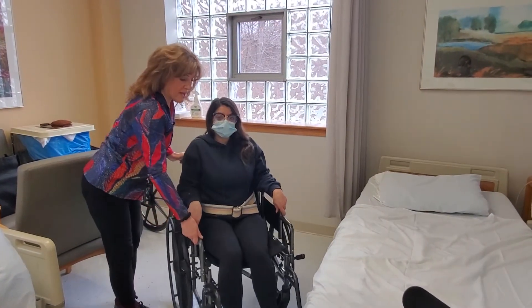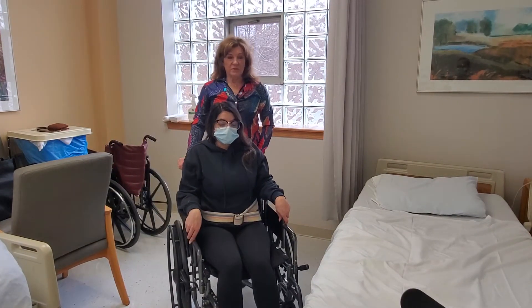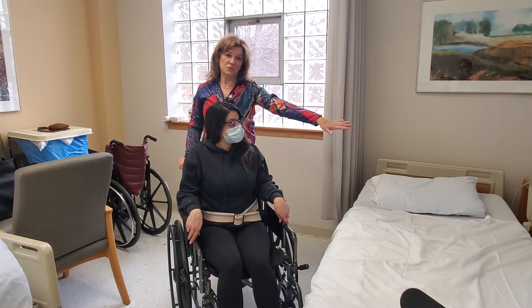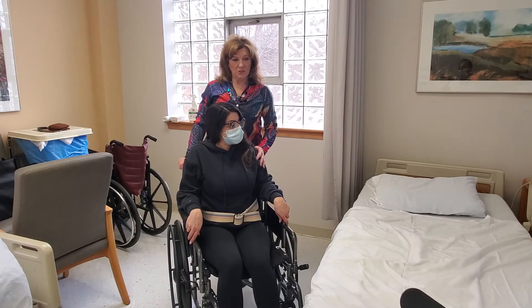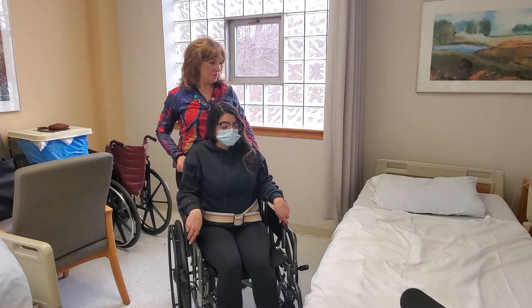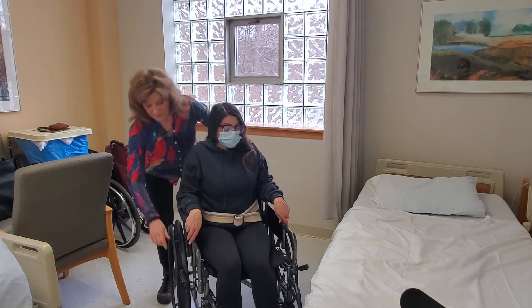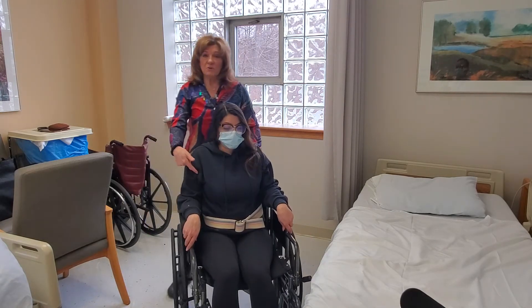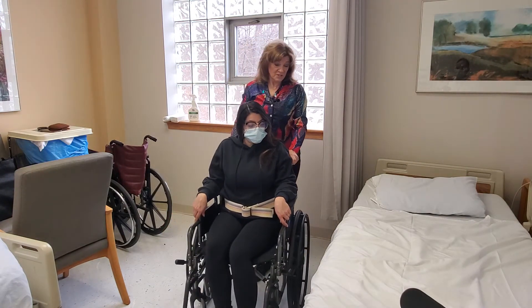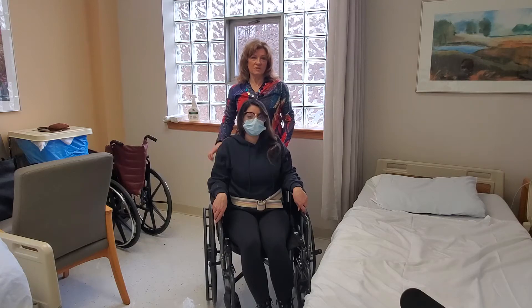If you were to get her back into bed, it's a little bit the opposite. Remember that this is her strong side and the bed is what she's trying to get into. You want to make sure you're changing the chair position to this end of the bed. You can leave the grab belt on her because you're going to need it again — and leaving it on her reminds you that it's ready for the next transfer.